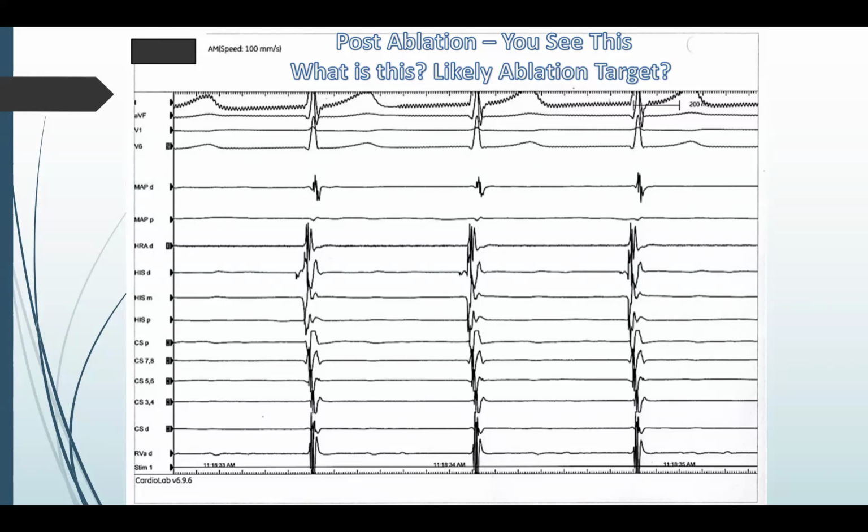And that's the reason why, as we've talked about in the past, people can have this condition called pacemaker-mediated tachycardia. When patients have pacemakers, they have AV block, right? That's the reason we usually put them in, if someone has heart block. But rarely what can happen is a patient can be paced in the ventricle and it goes retrograde through a still intact retrograde AV node.